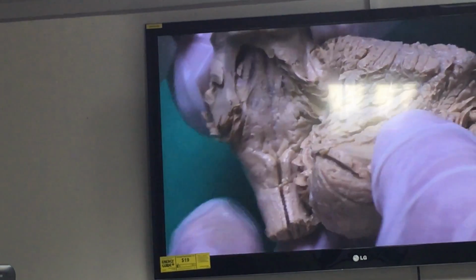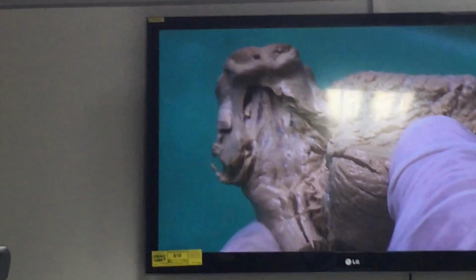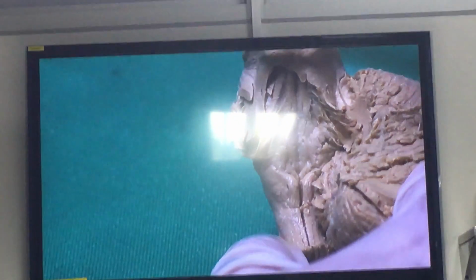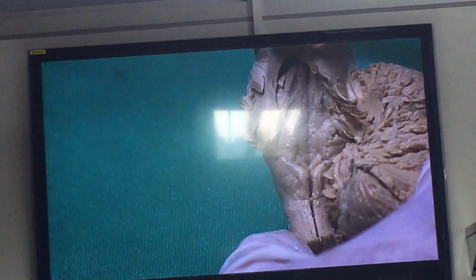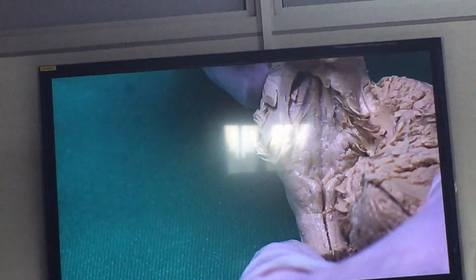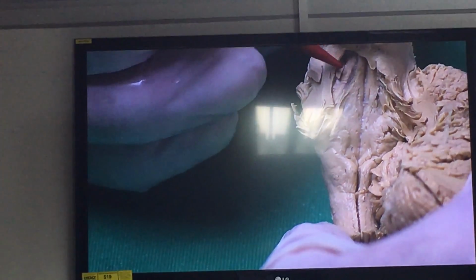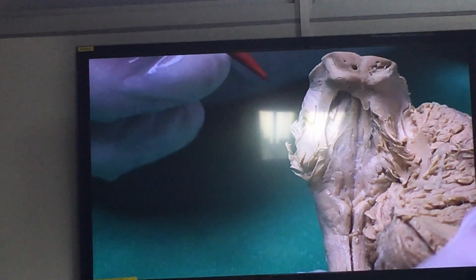So we can zoom in on it. Okay, very good. 300 marks. Okay, and you can see very, very clearly. This is so beautiful. And there we can see the what? The locus coeruleus. Do you see it? You see that black pigmented area? Right here. See the black pigmented area? That's the locus coeruleus. Right?